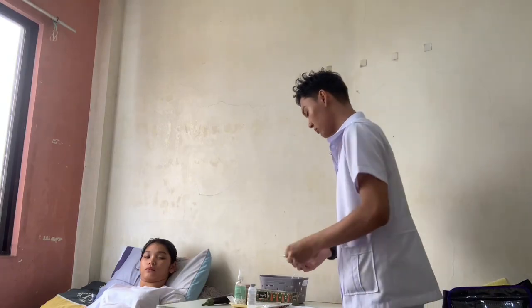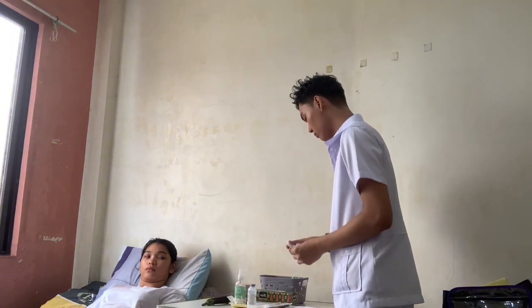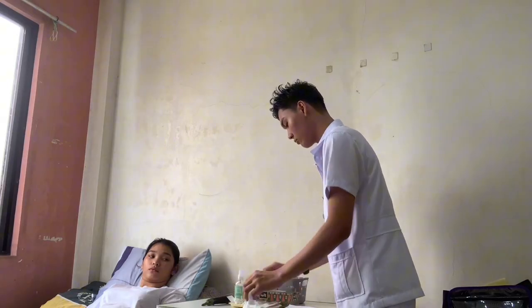Make sure that the connection isn't loose. Okay, since we are done, I will set it down. So now, I am done with preparing the vial.